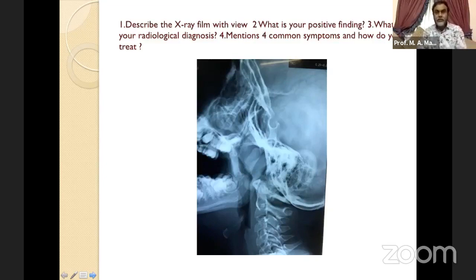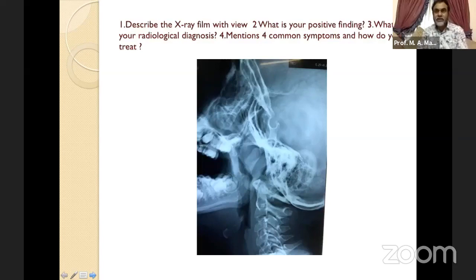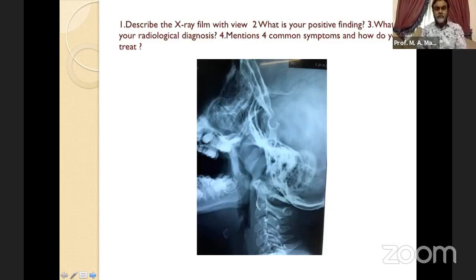Now look at this X-ray. First, describe it: this is X-ray soft tissue nasopharynx, lateral view. This description earns you 0.5 marks per point, so there is no reason to lose marks here if you know this. The next step is to identify the findings — it shows an increased soft tissue shadow, or enlargement of the soft tissue shadow, in the nasopharynx.